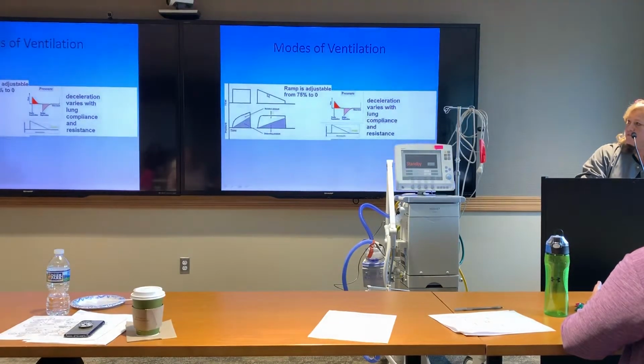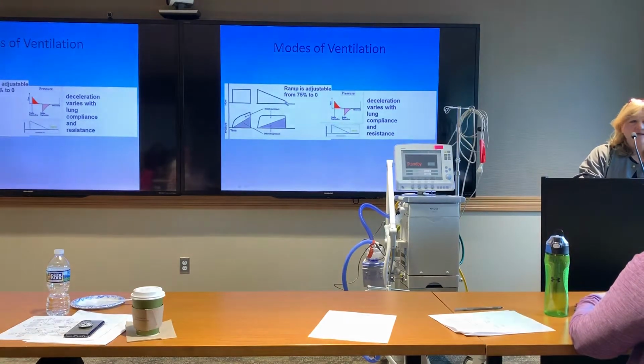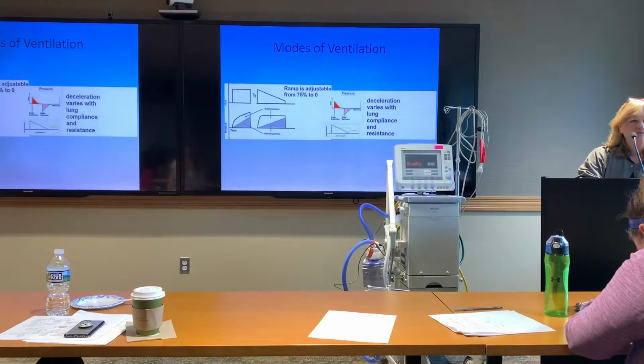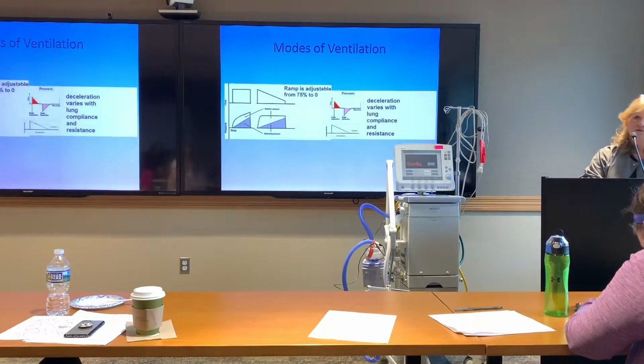And then it tapers down to whatever point, and I can set this point from anywhere. I can have it taper all the way down to baseline, or I could have it taper down 75%, or I could have it taper down 50%, or 25%, which is what I'm looking at here. That all just depends on how I taper it, which determines how quickly the tidal volume is delivered. So I can set that appropriately for the patient so that he's comfortable. It's really something I would do for comfort.